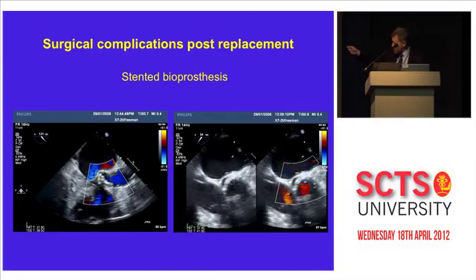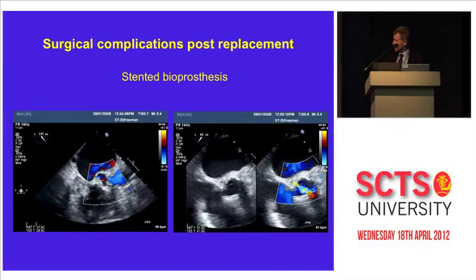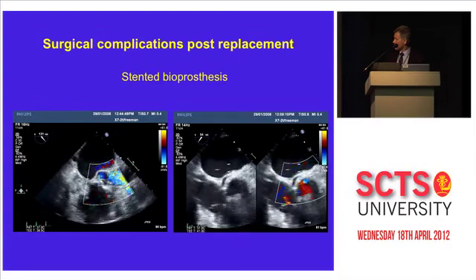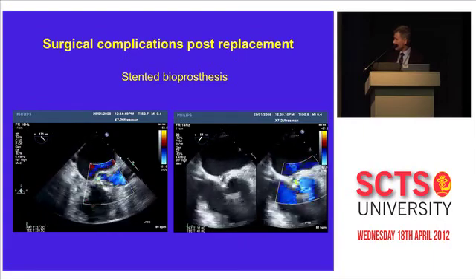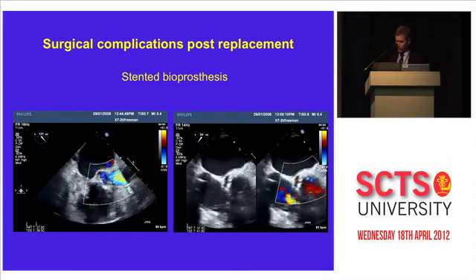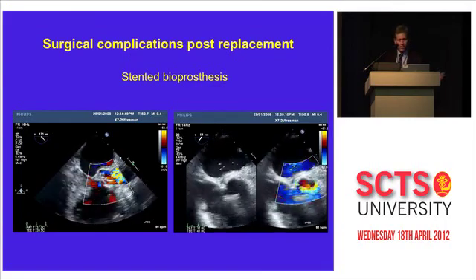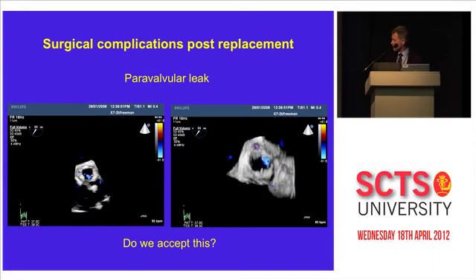However, if you really look carefully, you find that there is a tiny paravalvular leak on that side, and again, with your color compare, a jet coming from the intra-atrial septum side across the outflow tract, in a less than optimal direction, although hemodynamically not a big one. With 3D, again, it just confirms what we've got.